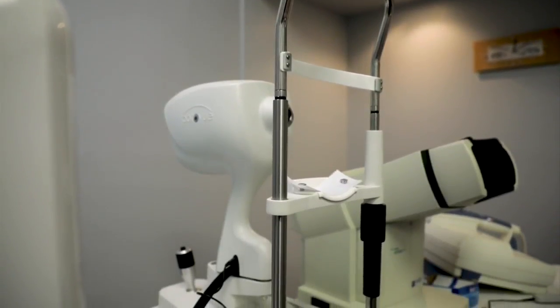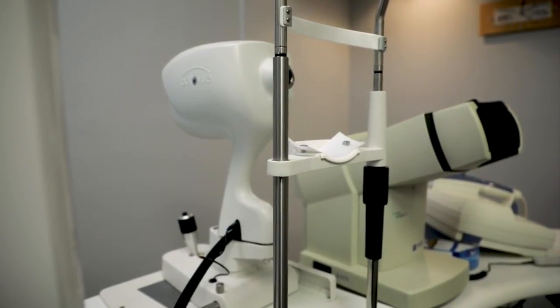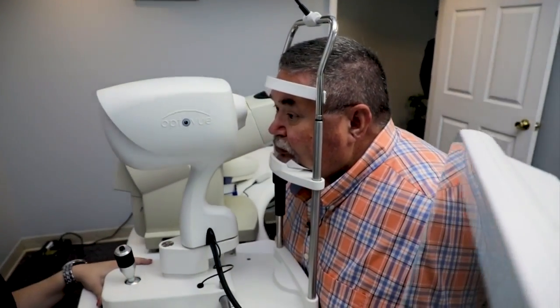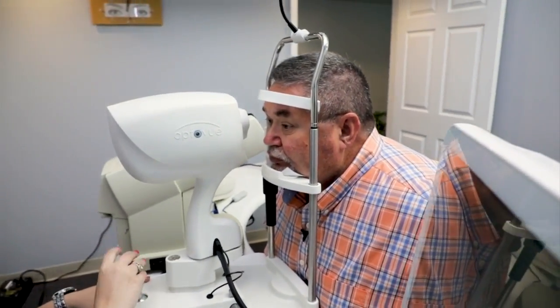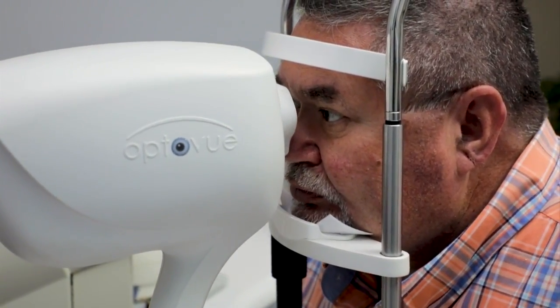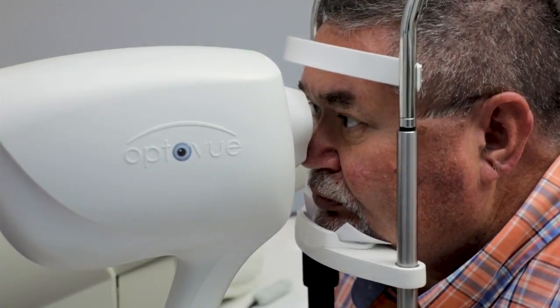So I guess we'll start off with the newer instrument. It's called the OCT, which stands for Optical Coherence Tomography. OCT, for sure. What it's really done is change the way we analyze the retina, the optic nerve, and the anterior segment. It's sort of like an X-ray, but it lets us see through all 10 layers of the retina. So it's a really important piece of equipment for our diagnosis and treatment, especially of glaucoma.